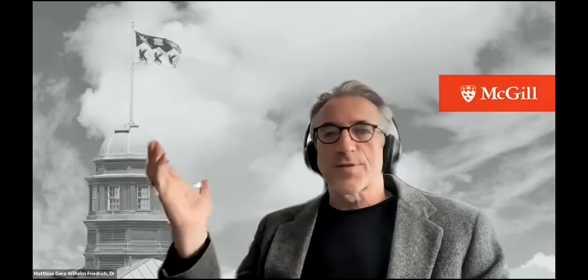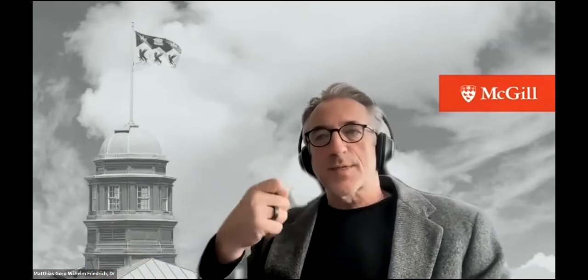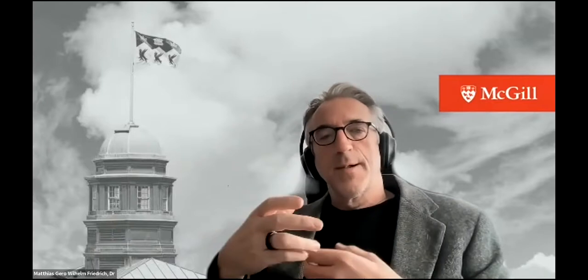If this patient, for example, maximizes physical exercise, goes for a half marathon or whatever, I could imagine that this stress poses enough injury that you develop edema, which over time, if you have repetitive edema, can even lead to fibrosis. So are you also looking at T2 mapping or T2 weighted imaging in these patients?